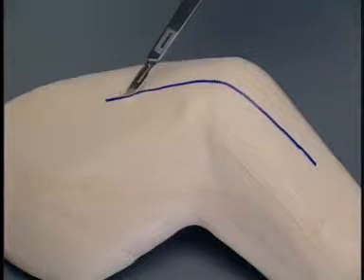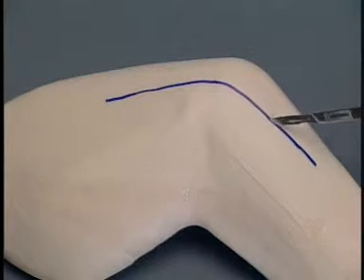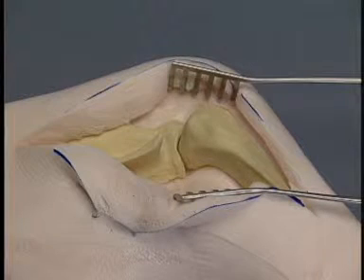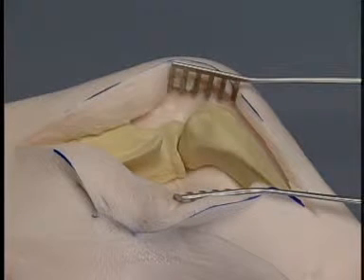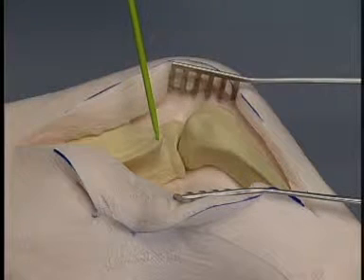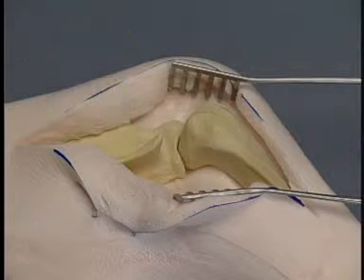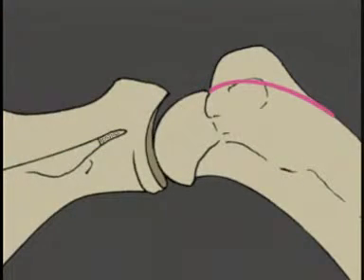The skin is incised on the lateral aspect of the shoulder to expose the distal third of the scapula and the proximal third of the humerus. The acromial process is osteotomized in the clinical patient to aid exposure of the joint. The next 3 ostectomies are shown.